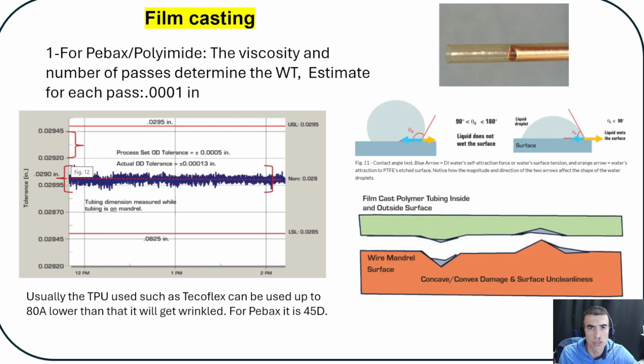We explained in our previous video how this multi-layer casting is done, and we will also explain in the next slide how these layers get combined eventually. But with PTFE as a liner, you can cast on it in a casting process and create a structure.